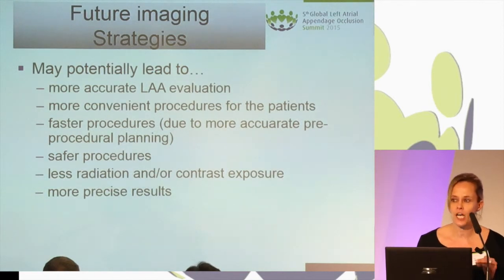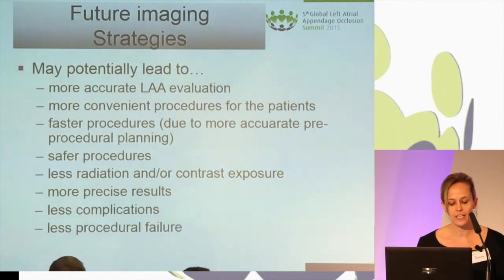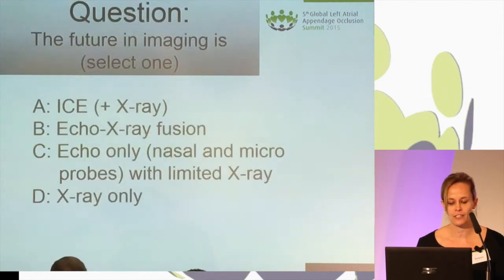So as long as we don't know what our leaks are doing to our patients on the long term, we should aim for no residual leak in every patient. It may also lead to less complication and less procedural failure. So thanks a lot for your attention.